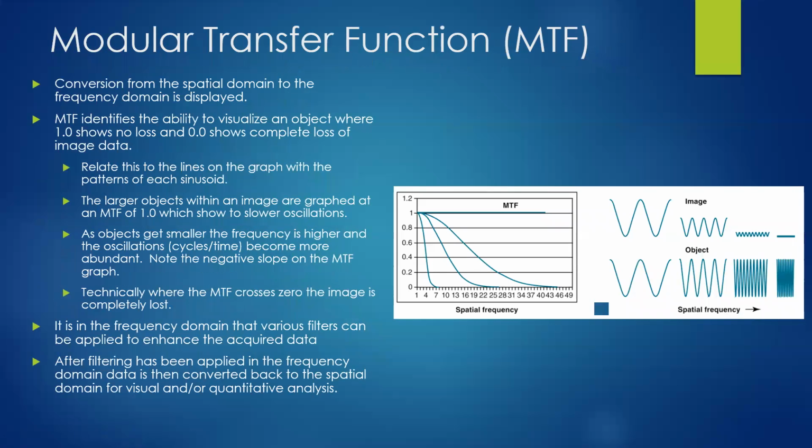Modular transfer function. Another interesting point of view. So MTF, as I'll refer to it from now on. An MTF actually looks at the spatial domain, and I like to say that it also assesses the frequency domain. It looks at the frequency domain and the spatial domain and gives us our ability to say, well, how well can I see that object?